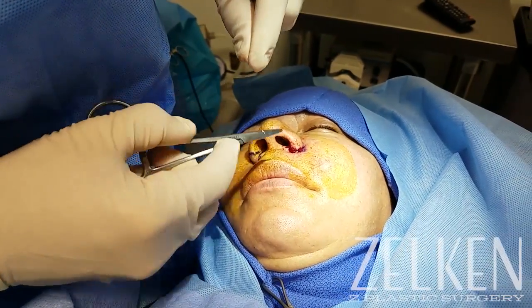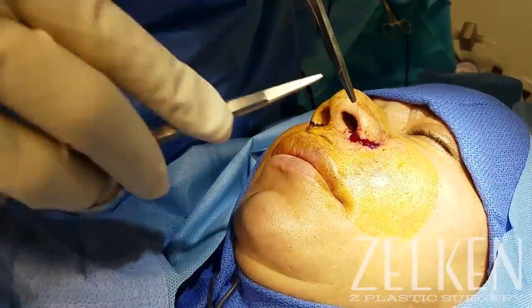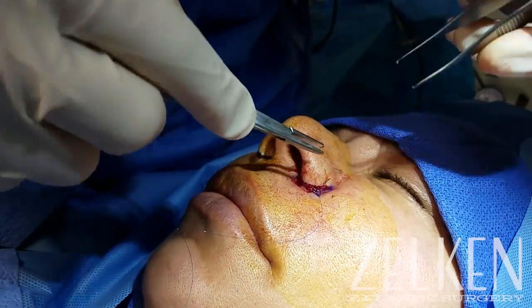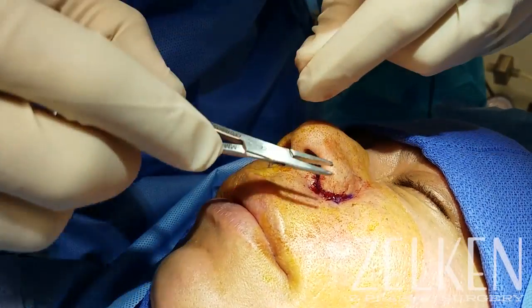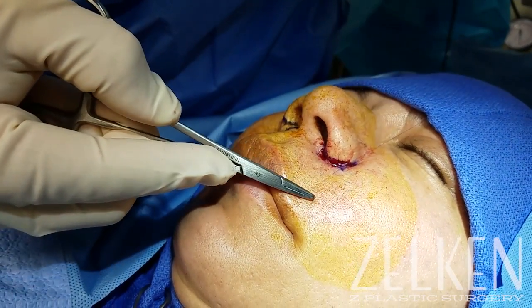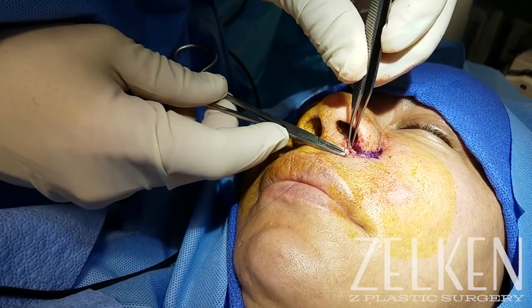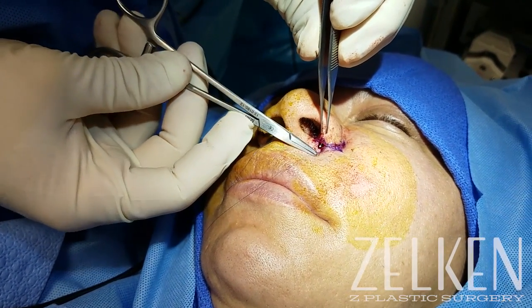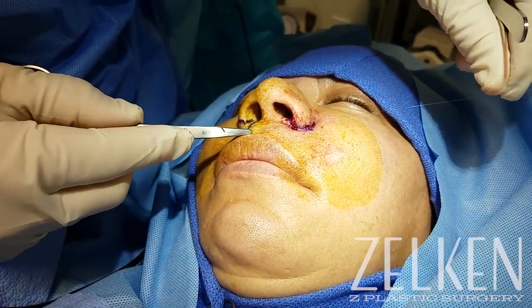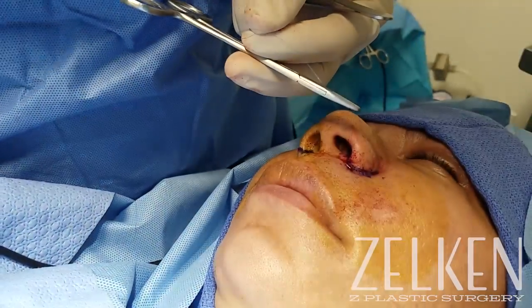I really make every effort not to pinch the skin with the Adson forceps, and I try to make everything as gentle on the skin as possible. I do see dermal oozing throughout the procedure, and I'm perfectly fine with that. When I do grasp the skin, it's very, very delicate — this skin is very friable and it doesn't tolerate much tension or trauma. In order to make this scar, especially in a Latina patient, as invisible as possible, I try to use the most atraumatic technique possible, including conservative electrocautery. Just lateral to the lateral ala, there is an angular vessel that when it bleeds will require a lot of electrocautery to control it. So I prefer to visualize that vessel and steer clear of it, because breaking through it requires a lot of electrocautery, which will in turn create trauma and a theoretically worse scar.